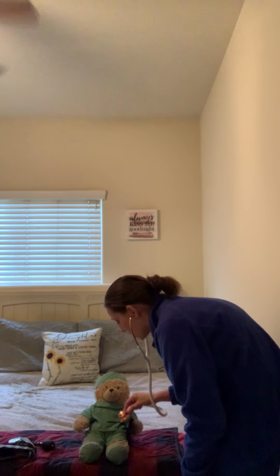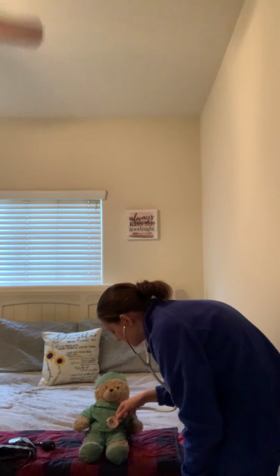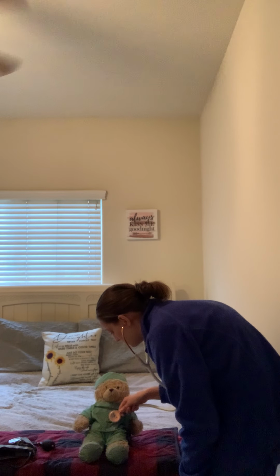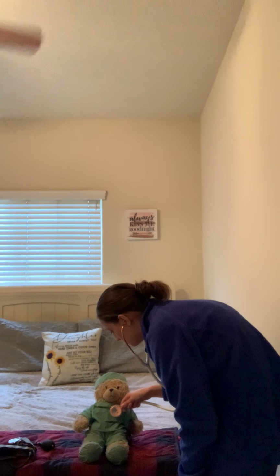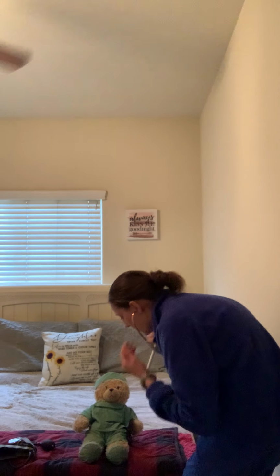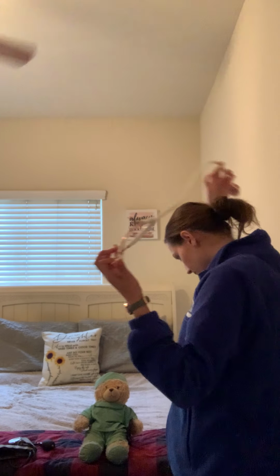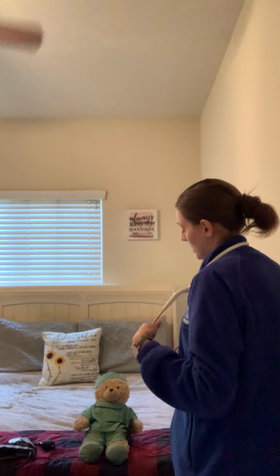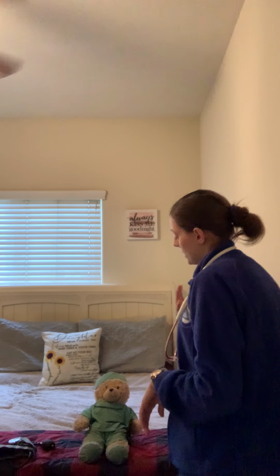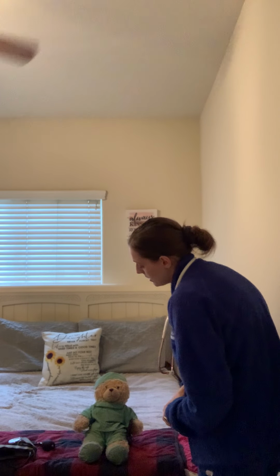And I'm going to go ahead and go backwards in those 5 spots with my bell. And I'm just listening for any extra heart sounds, but I did not hear any murmurs or extra heart sounds on my assessment. Then I can go ahead and move to his abdomen. So I'm just going to have him lay back and inspect his abdomen.